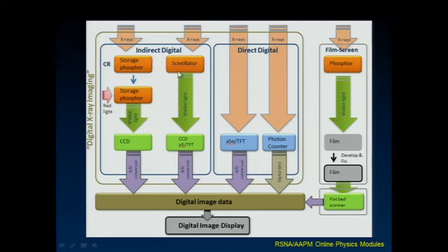There's another indirect technique that uses a scintillator instead of a phosphor, and some of the flat panel detector systems use this. Remember, these give off light immediately. You don't stimulate them. So they're not useful for doing a portable X-ray and coming back down to read that. The image has to be read off as it's being exposed. And that's still done. That high energy X-ray light is converted to visible light that's then read by an amorphous silicon or thin film transistor array CCD camera.